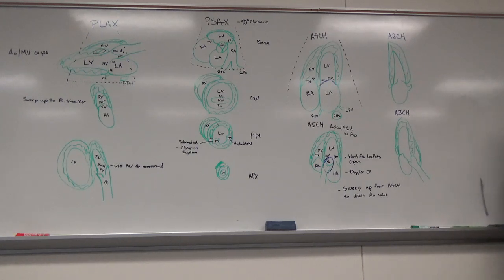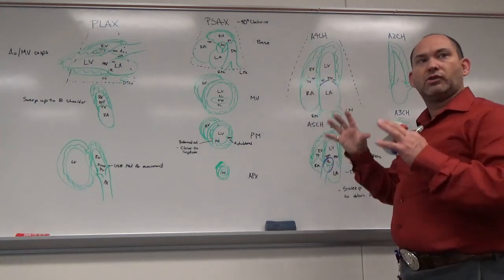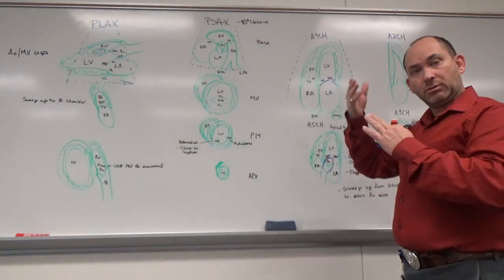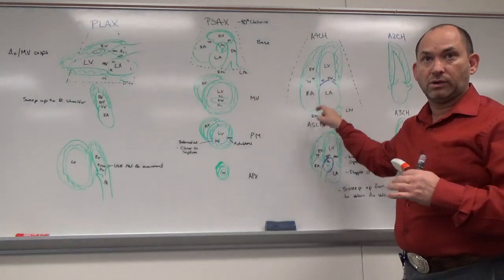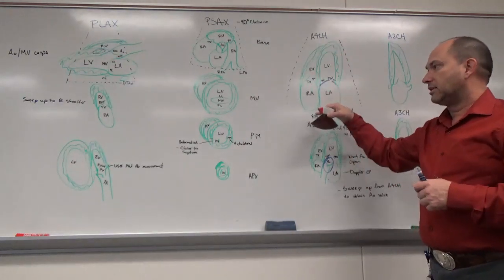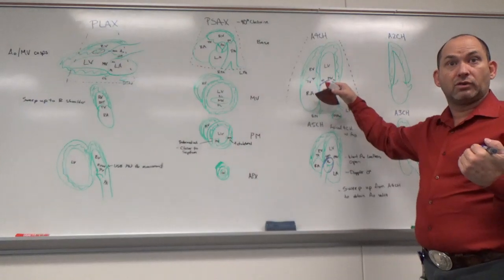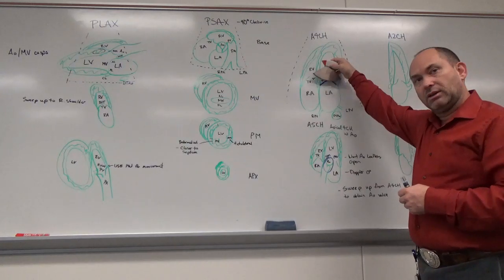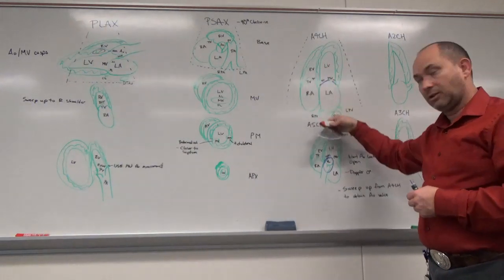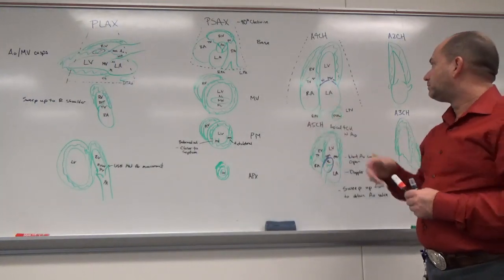Yeah, because your first view is going to be the 4-chamber, and to get the 4-chamber, if I'm angled correctly, I want both of these chambers to be as open as they can each be. I want them exactly in the center of the LV and exactly in the center of this, as well as the atria. Now, I said already that when you're looking at the heart, the inflow tracts are at the back of the heart. They're near the spine. So I'm actually tipped back posteriorly, and then I have to tip anteriorly intentionally to get the 5-chamber to open. So these are very posterior structures in the heart.